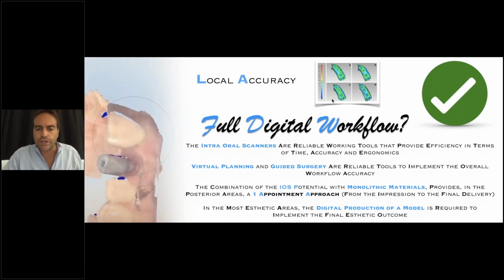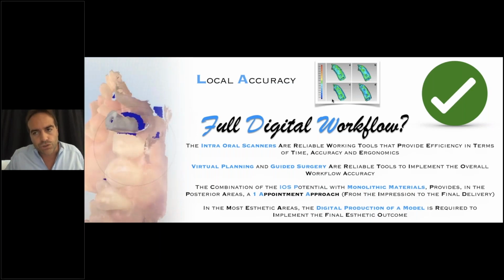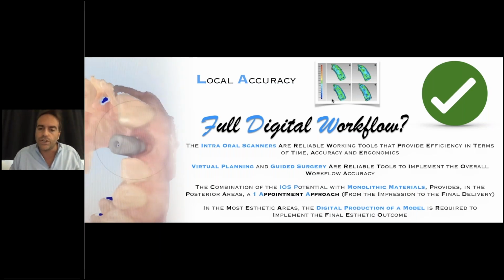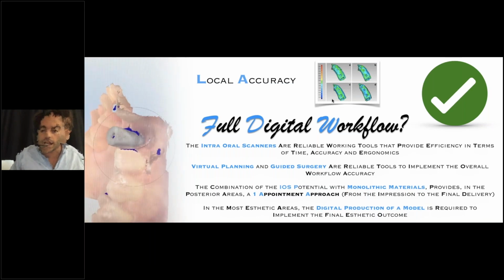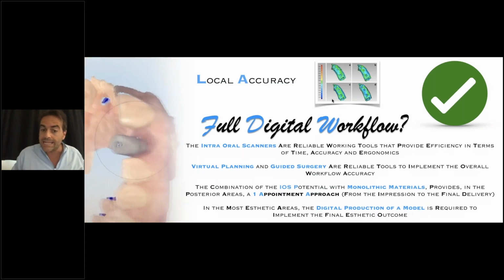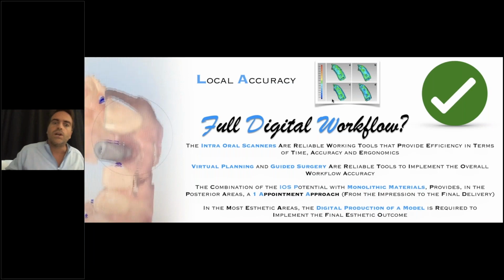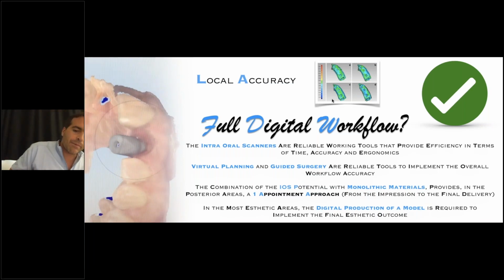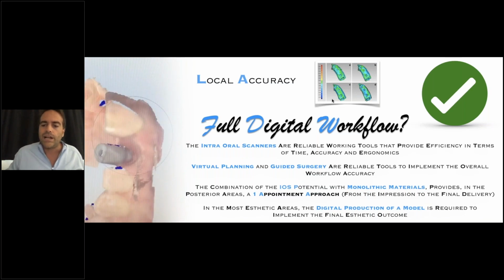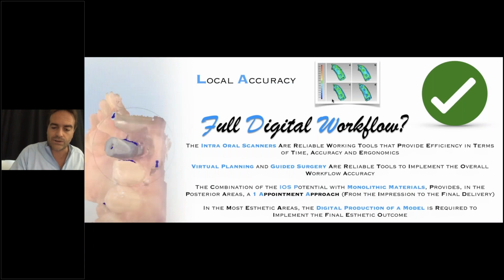The combination of the intraoral scanner potential with monolithic material, which is our suggestion in posterior areas, gives us the opportunity to offer the patient a one-appointment approach, from the impression to the final restoration. And in the most aesthetic areas, as I mentioned, the digital production of the model. So don't forget to use a scan body, and a company that also offers the digital implant analog, as they are necessary to achieve the final aesthetic outcome.